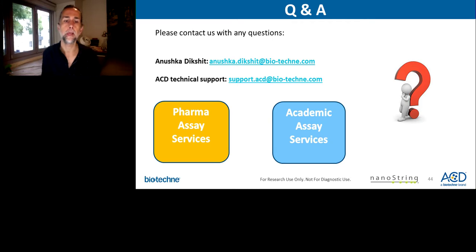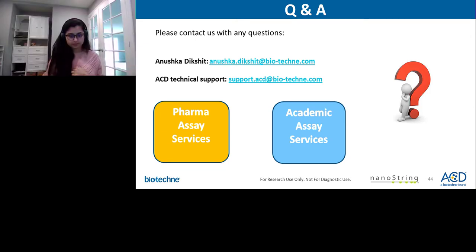Anushka, another question for you here. Can the RNAscope GeoMx workflow be performed only using the Leica automated platform? The RNAscope GeoMx joint workflow can be performed both on a manual as well as an automated platform. The automated platform is performed on Leica, but we do have a joint workflow that is available for manual assays as well. So you can perform it using both manual as well as automated assays.